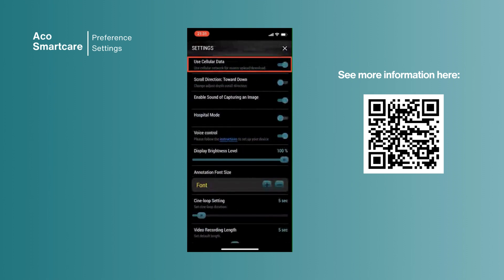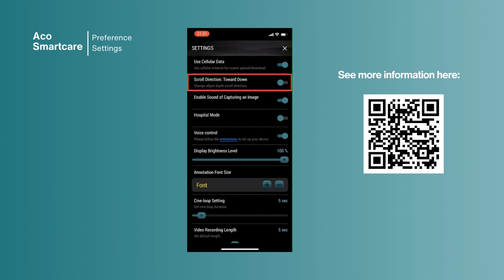You may enable use cellular data for exams upload and download. The feature with scroll direction gives you an option to scroll in different directions. By enabling sound of capturing an image, you will get a sound notification when you capture an image during the scan.